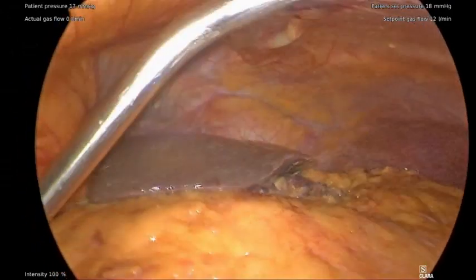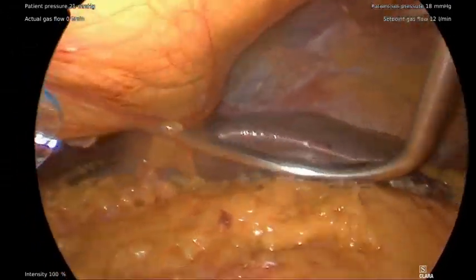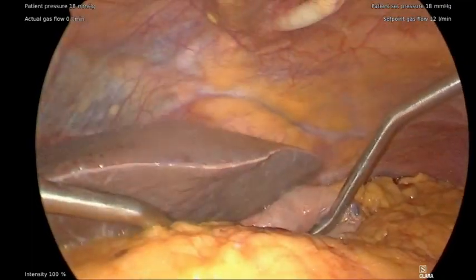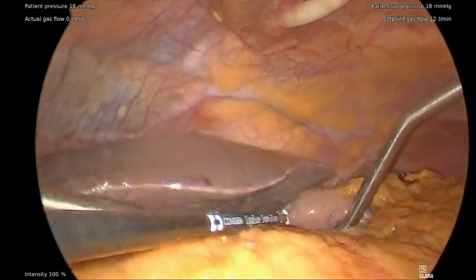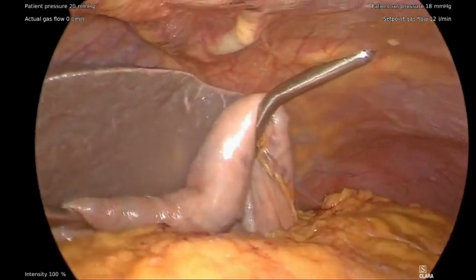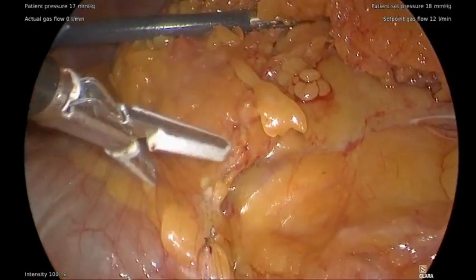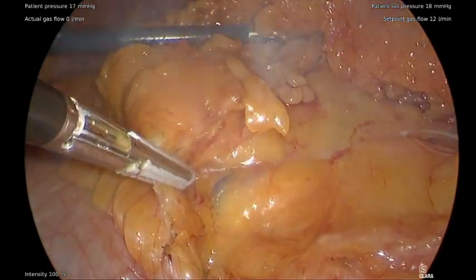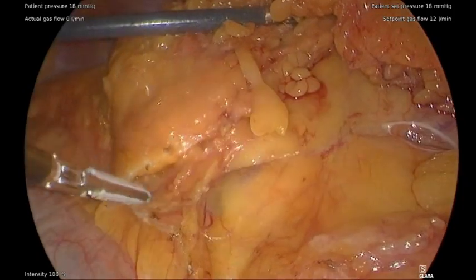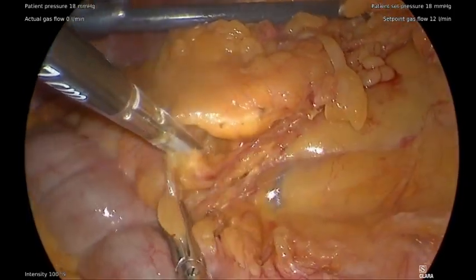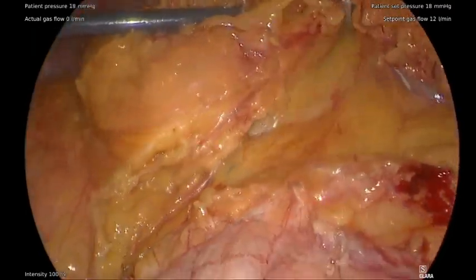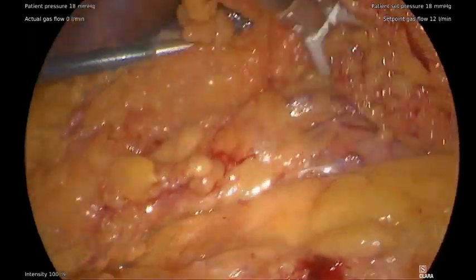Next, a Nathanson retractor is inserted into the abdomen for retraction of the liver and the greater curvature of the stomach. The greater omentum is then dissected free from the transverse colon towards the hepatic flexure, being careful not to injure the gastroduodenal artery. An avascular plane can be seen.